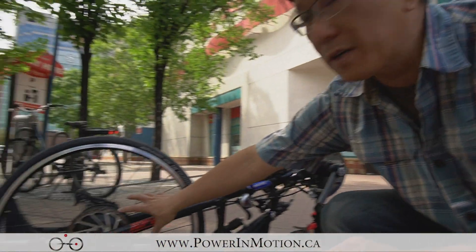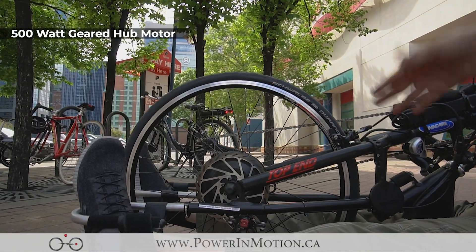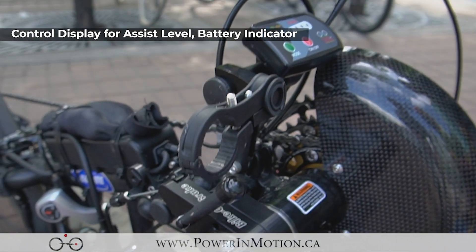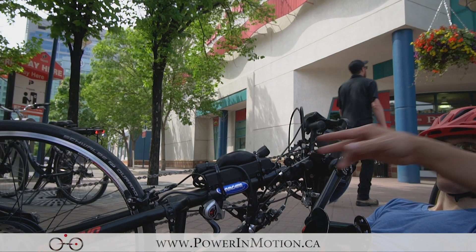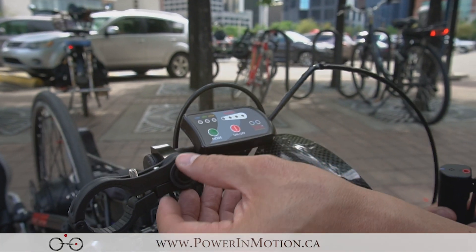Let's quickly talk about the configuration. We have the hub motor here — this is a 500-watt gear hub motor on the front wheel. We have the control panel; I'll just turn it on to show you how it works. And this is where the controller is — we're mounting the controller right there.